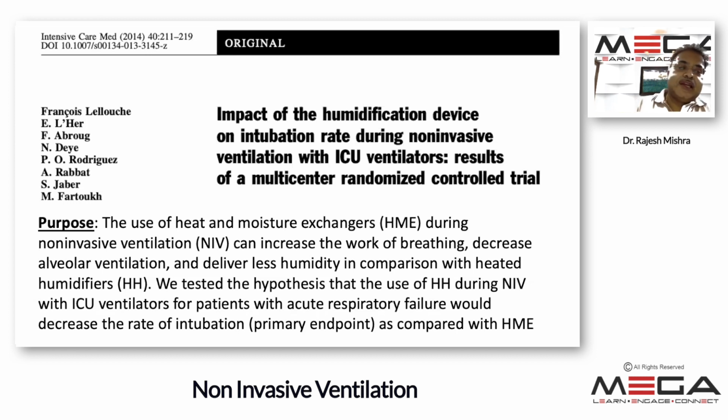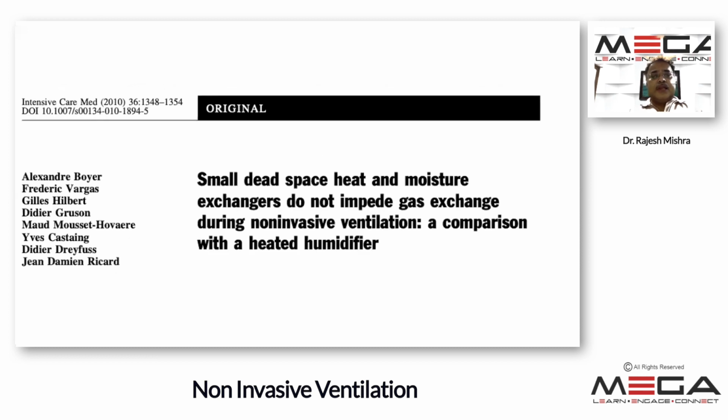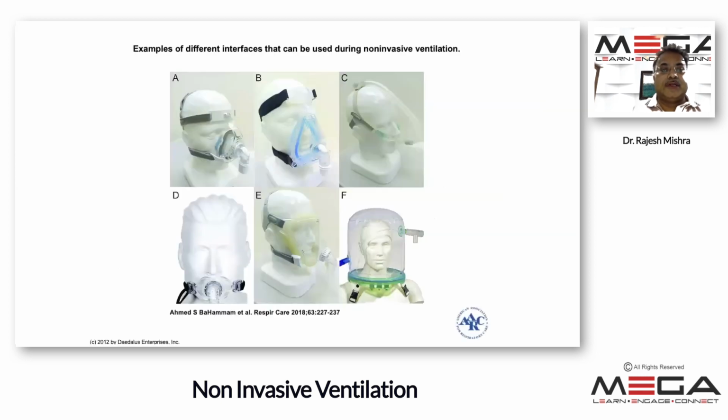But this trial has clearly shown that HME or HH, that is heated humidifier or heat and moisture exchanger, does not increase dead space, does not increase work of breathing, and is a must to get an appropriate physiological response. That's one thing I want to tell. A small dead space HME does not contribute to the gas impedance in non-invasive ventilation.